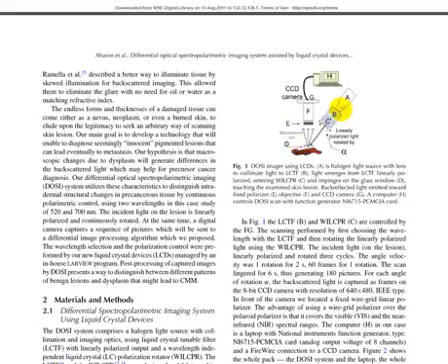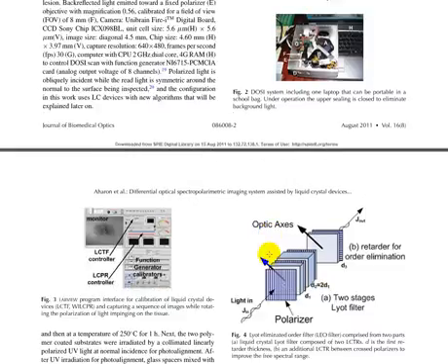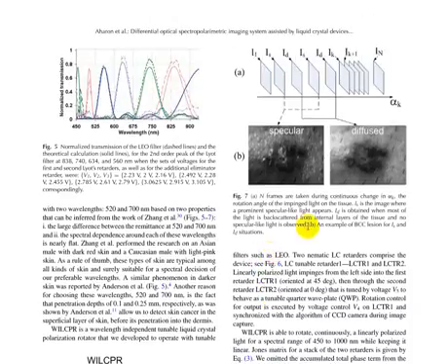So what I'm doing is actually using different kind of polarization in the light source and different kind of polarization in the camera, and produce a mathematical differences between them. So, for example, if this is the sequence of my imaging, when every picture is a different polarization and not just two, like the well-known methods today, here the main difference is that I'm using a lot of kind of polarizations and trying to extract from them the scattering light, symbolizing the areas which have high distortion and low distortion, and I'll show it in a minute.